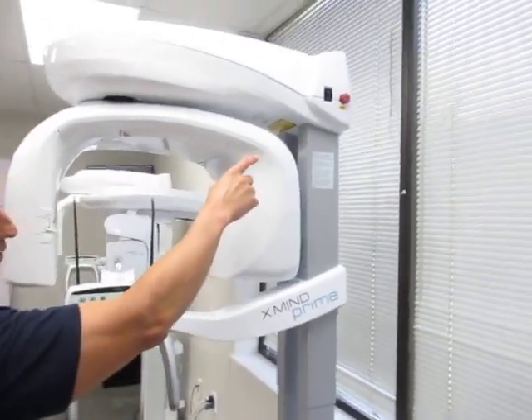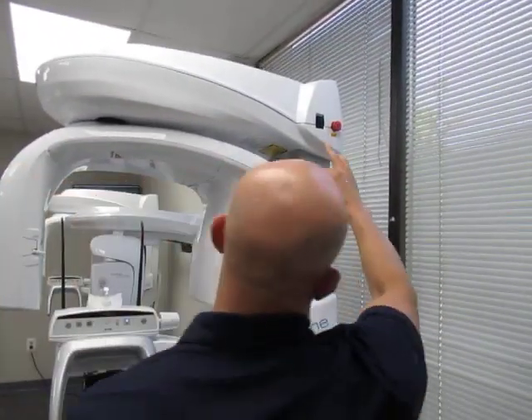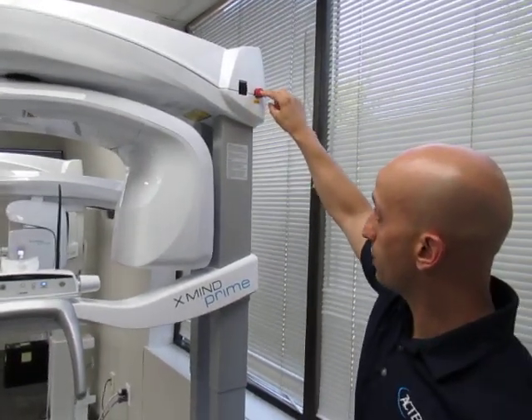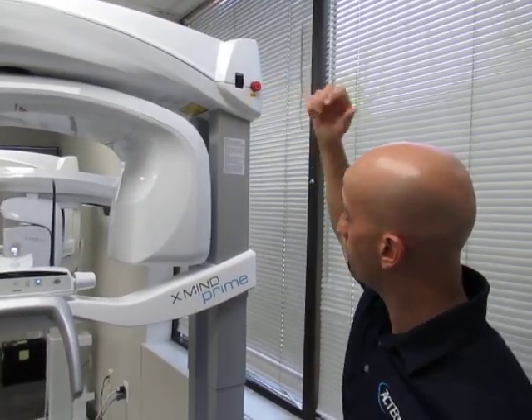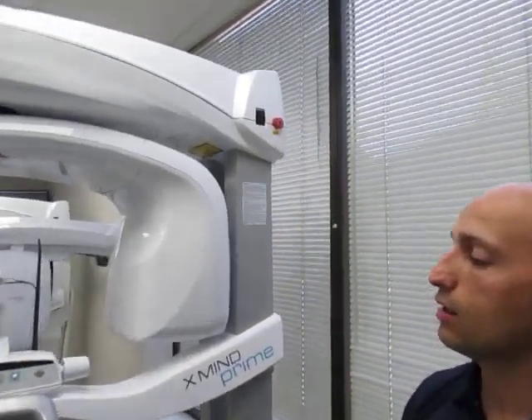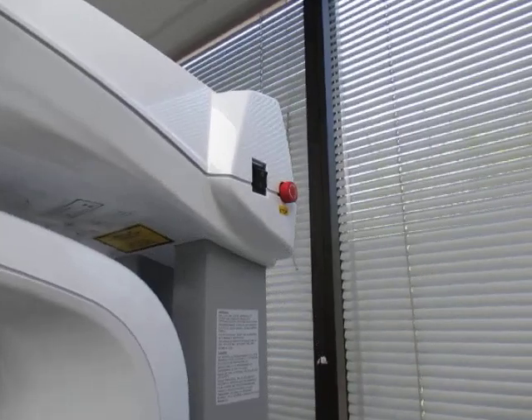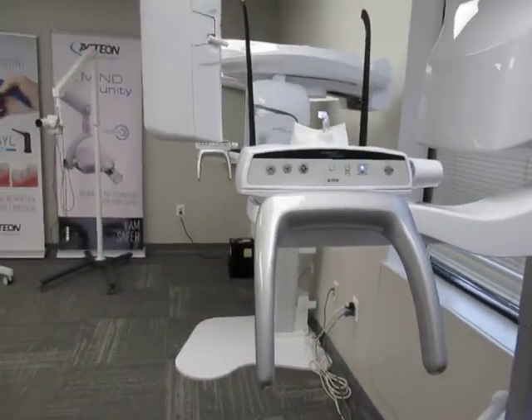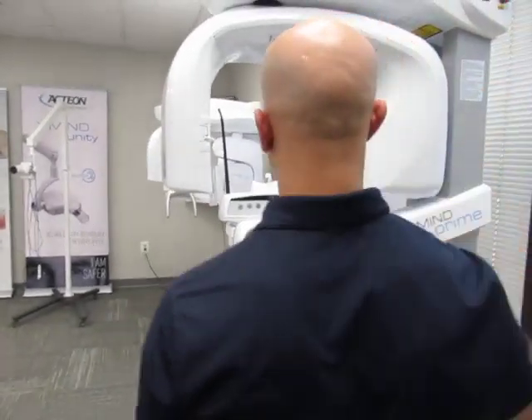On the top right-hand corner there's a power button — one is on, zero is off. This red switch is an emergency switch. You want to make sure this is compressed outwards, because if it's pressed in you'll still have power at the unit, but it locks the column from going up and down. So make sure this is out.